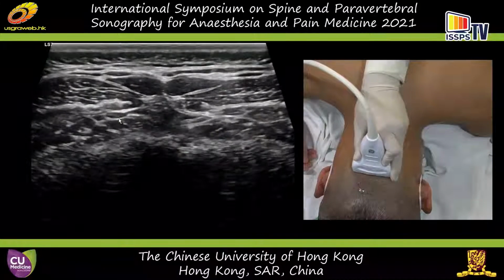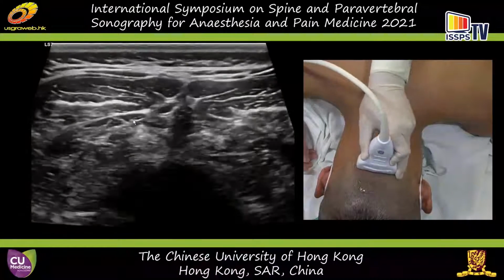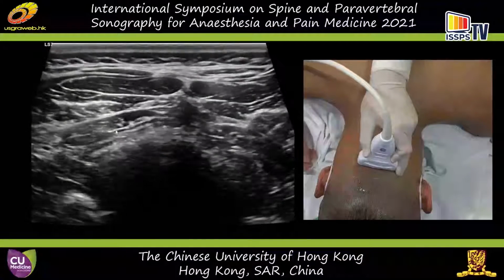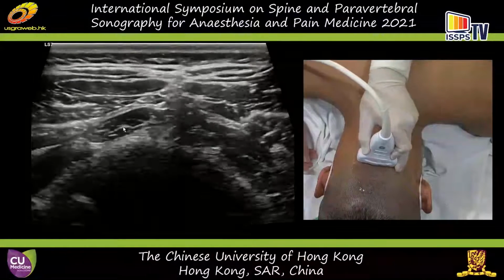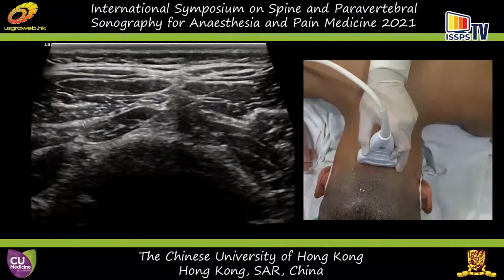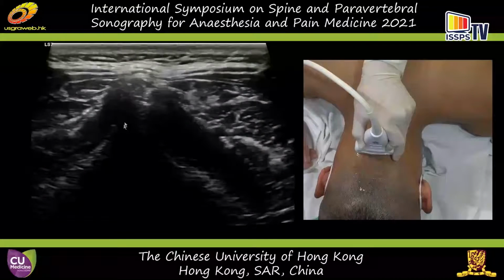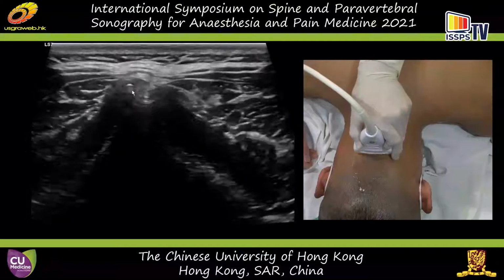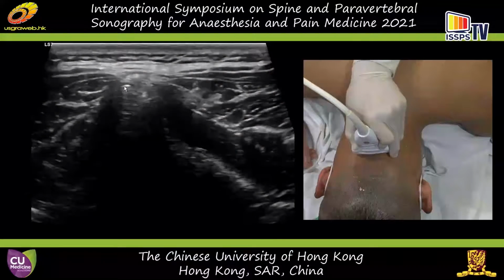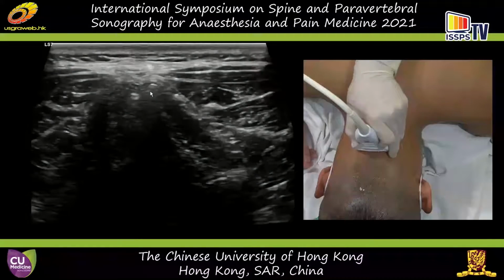And this is the rectus capitis posterior minor muscle, and the major muscle is much bigger. It's going to insert into C2. This one is the major muscle. Rectus capitis posterior major is going to insert into the C2 spinous process, which is the bifid spinous process. This is the one, and this is the other one. It's the bifid spinous process of C2.